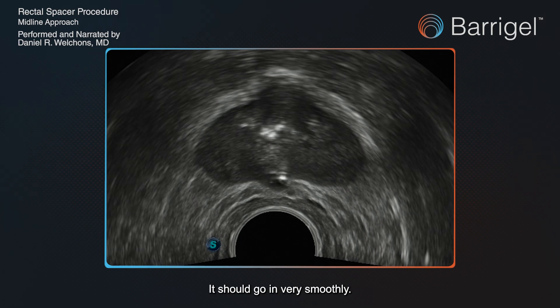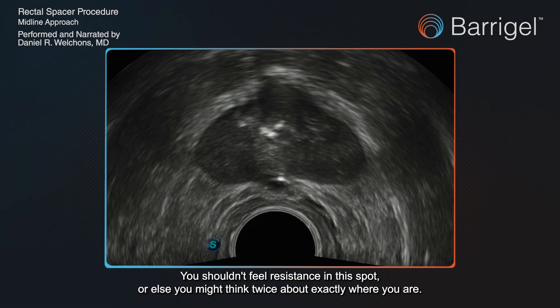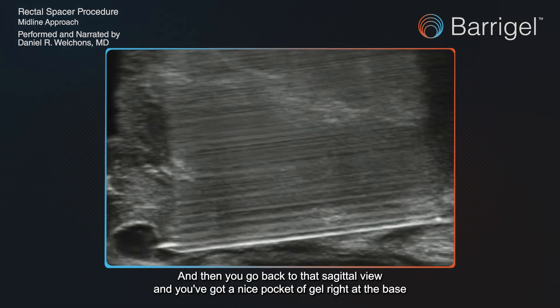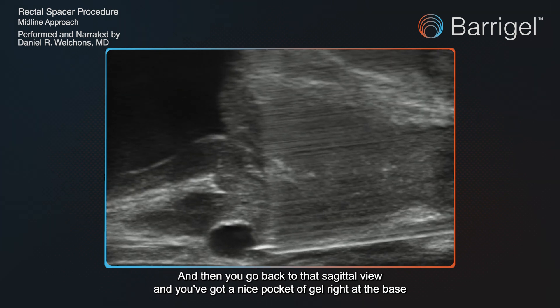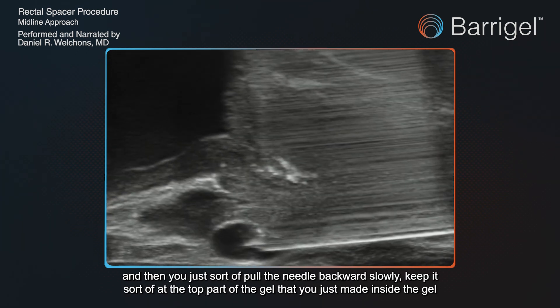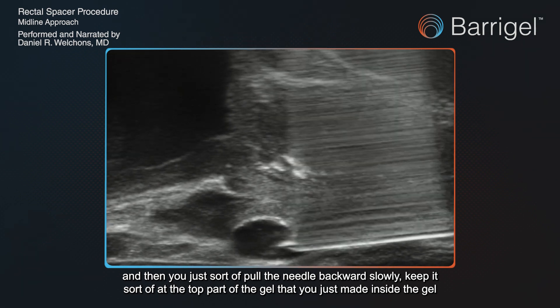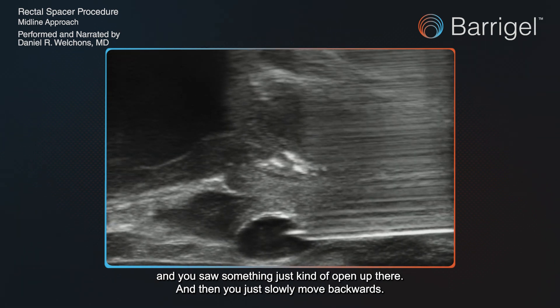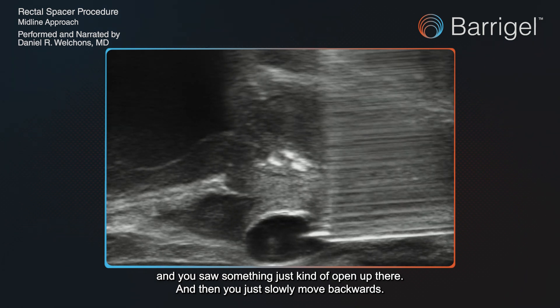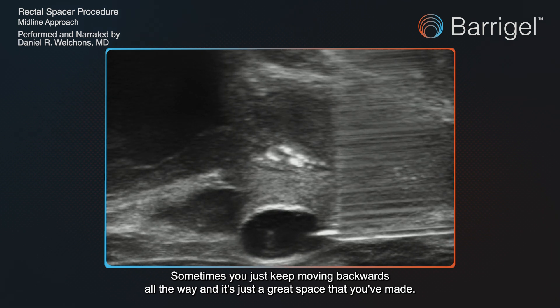It should go in very smoothly. You shouldn't feel resistance in this spot, or else you might think twice about exactly where you are. Then you go back to that sagittal view and you've got a nice pocket of gel right at the base, and then you just slowly pull the needle backwards, keeping it at the top part of the gel you just made. You slowly move backwards and the space just opens up.